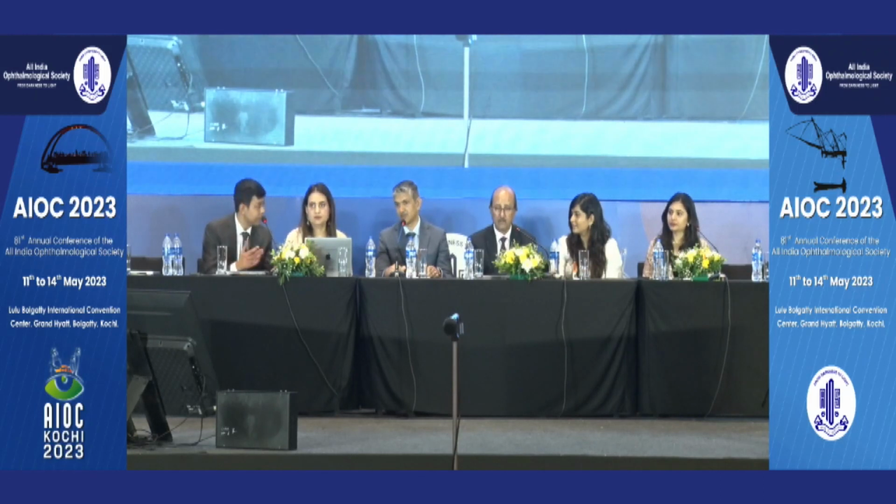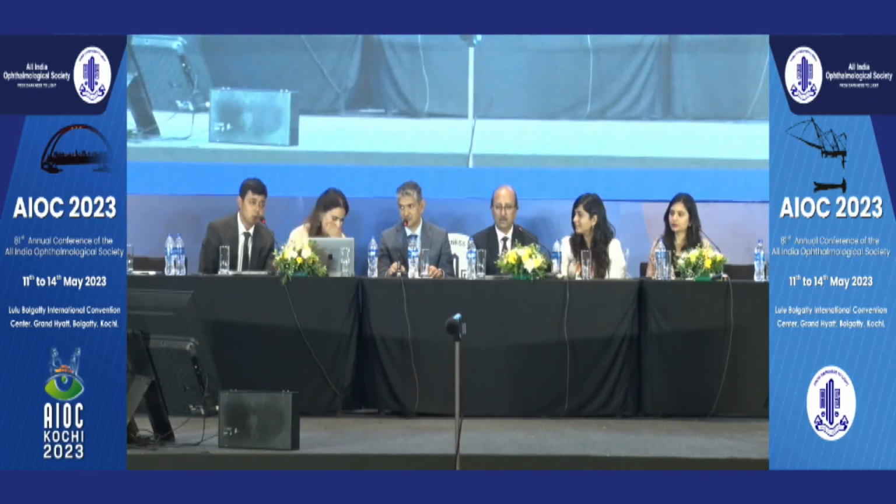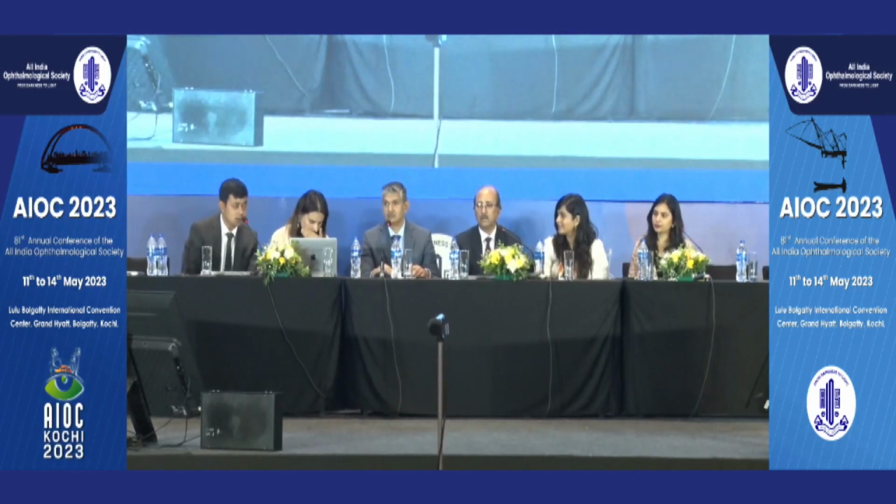That's a very important point. Later on, for putting in a piggyback IOL, even phakic IOLs like the ICL or IPCL also work extremely well as a secondary option for piggyback lenses. They might be slightly cheaper alternatives to the Rayner, and might be more easily and more quickly available, whereas sometimes the Rayner Sulcoflex has to be customized. You also have add-on lenses available from Indian companies, which are quite effective, and you have both monofocal and trifocal variants available.